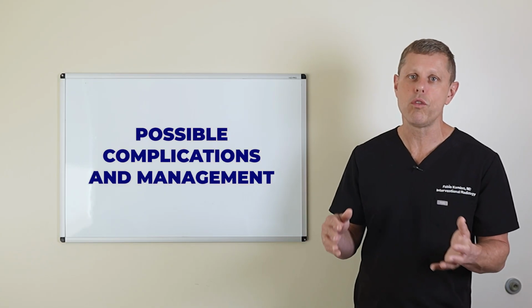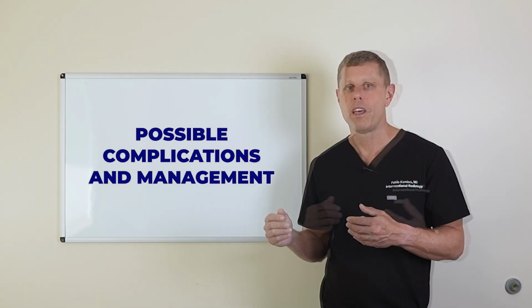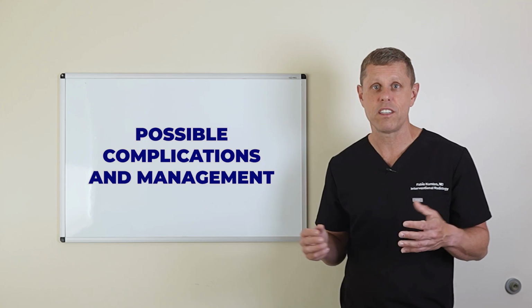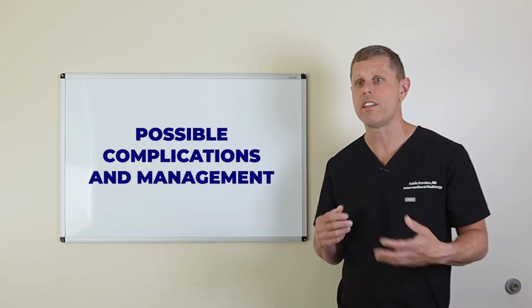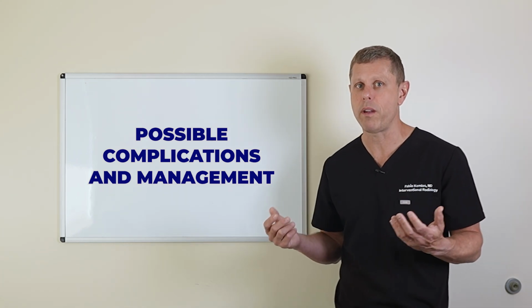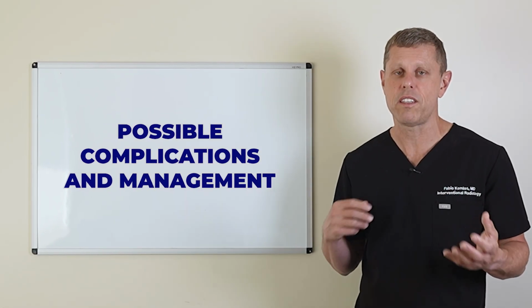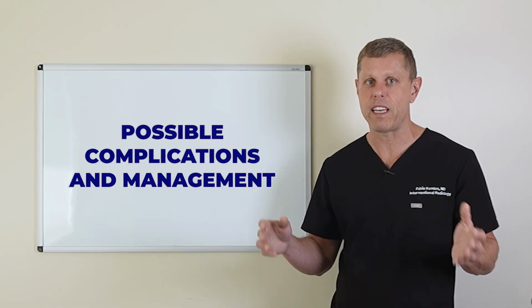But even if we do that, you need to be on blood thinners afterwards. The question is, if that happens after we clear the clot and start the blood thinners, do we keep the catheter in the same place? Do we take the catheter out? Do we put it in another place? And that will be a decision between you and your doctor, and we'll be happy to discuss and see, but it's done on a case-by-case basis.